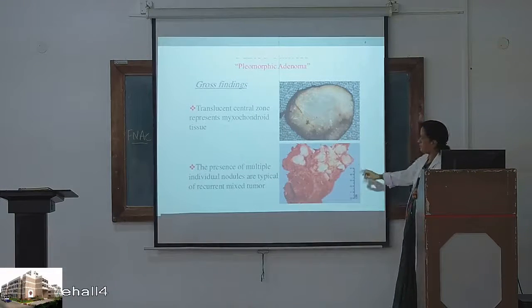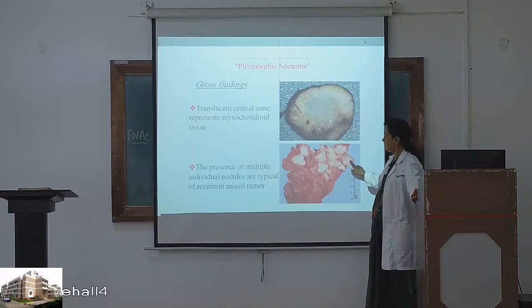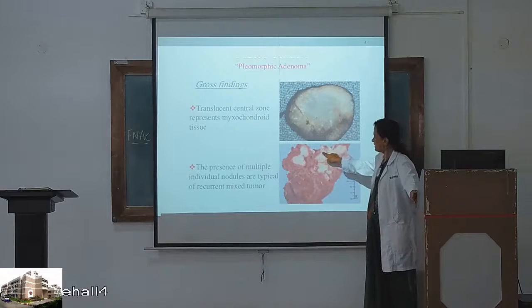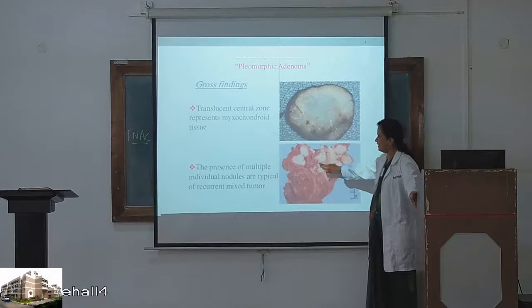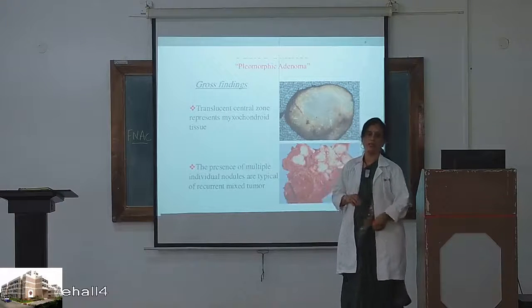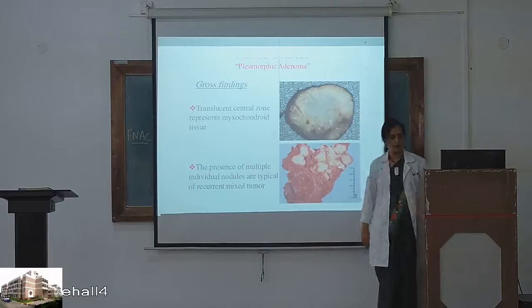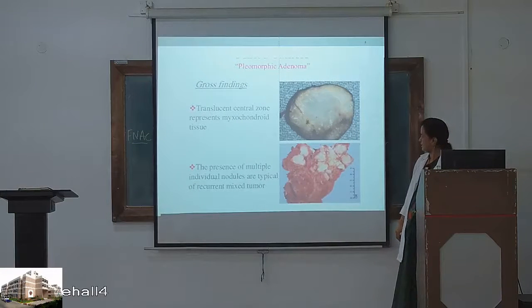Then here, compare with the previous two diagrams, this is the nodularity. See, multiple nodules are there. It is not just a single well circumscribed lesion as we saw in the previous specimen. So multiple nodules are there. So nodularity.